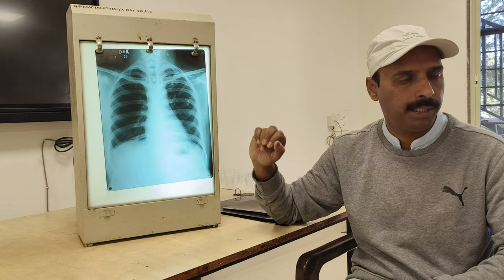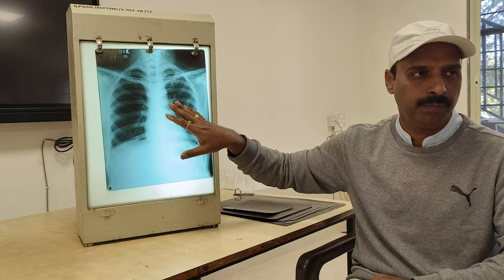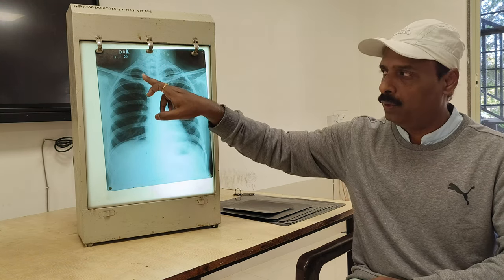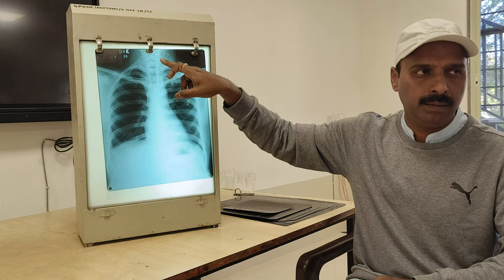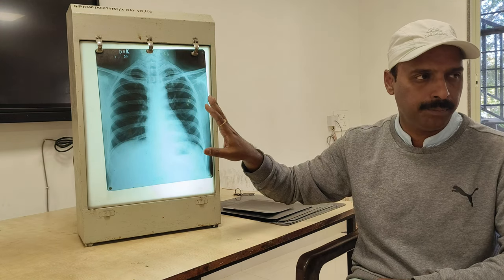So when you see this type of X-ray, you have to read it, and the points you have to write are important. This is a PA chest X-ray, which shows the different organs of the chest region. Centrally we have the heart shadow, and here also we have the arch of aorta and descending thoracic aorta. Here we are going to get the apex of the heart. Then both side lung shadows and the rib cage are seen. We have the clavicle on both sides, in the upper part the lower cervical and upper thoracic vertebrae, and inferiorly the dome of the diaphragm. On both sides you have to remember the right dome and left dome of the diaphragm. Okay, so this is a PA chest and how to read it.